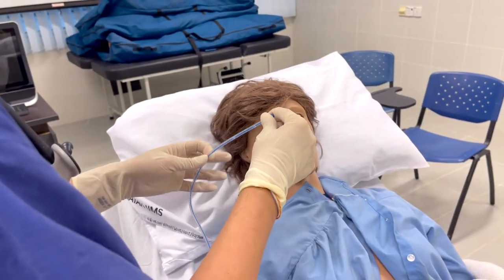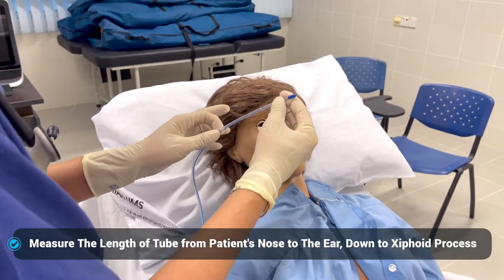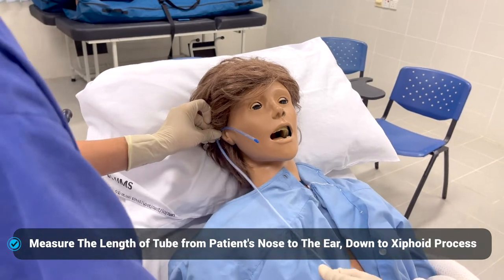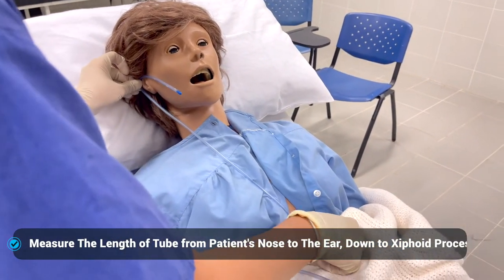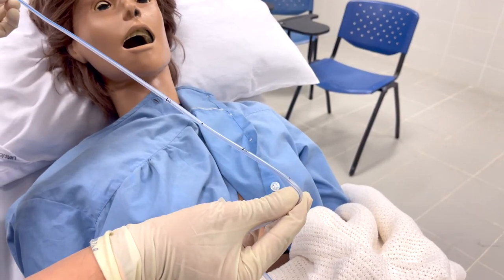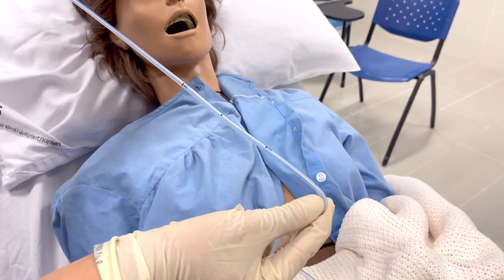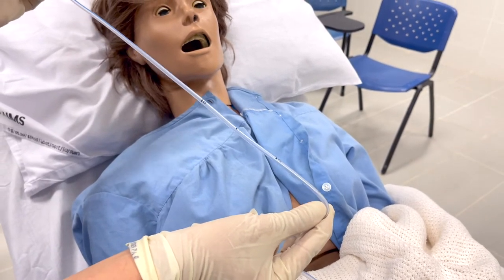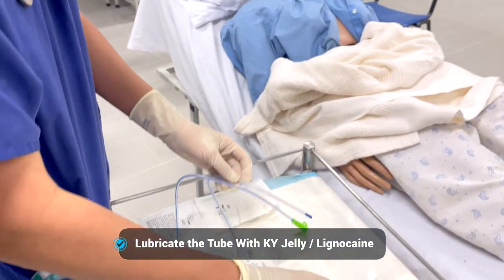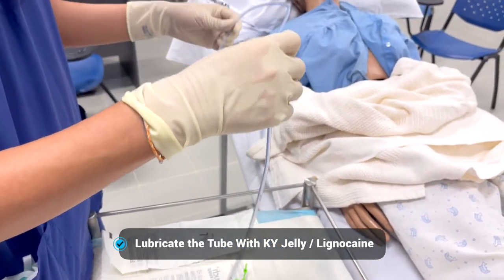First, we must measure the distance of the Ryles tube from the tip at the nostril to the earlobe, and then from there to the epigastric region. The measured distance is approximately 50 to 60 centimeters, which is the length that must be passed down from the patient's nostrils. After that, we apply lubricant to the entire tube.